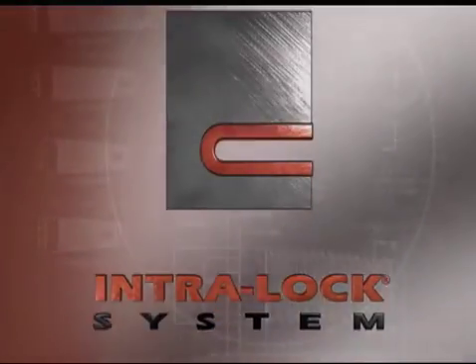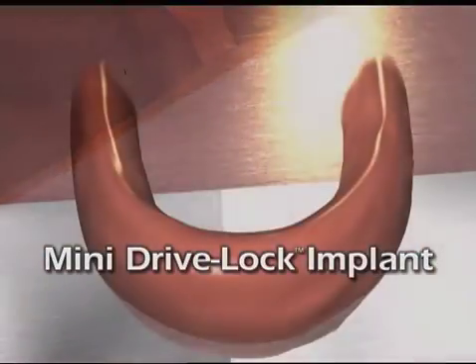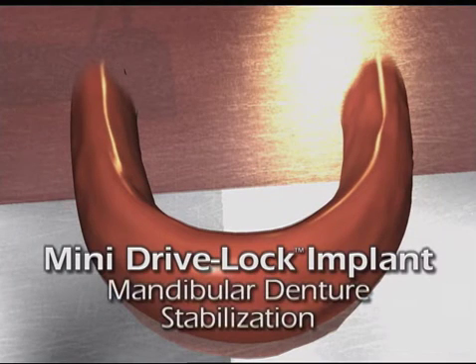Watch how DriveLock technology and intelligent engineering simplifies, streamlines, and improves mini implant delivery and placement in this mandibular denture stabilization demonstration.